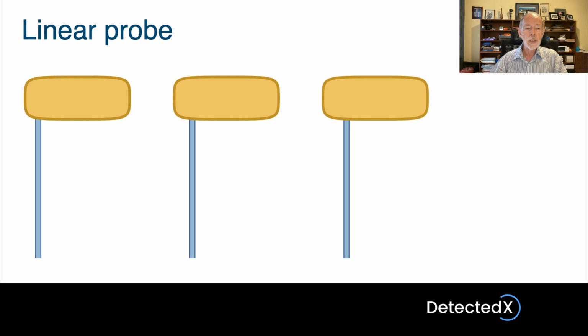So then in the center we see that the beam has been stepped to a new position. It's been stepped by a small increment to the right, and that process is going to be repeated. So again, the machine will transmit, receive echoes, wait until all the echoes have come back and there are no more detectable echoes, and then it will step the beam again and repeat the transmit-receive process.